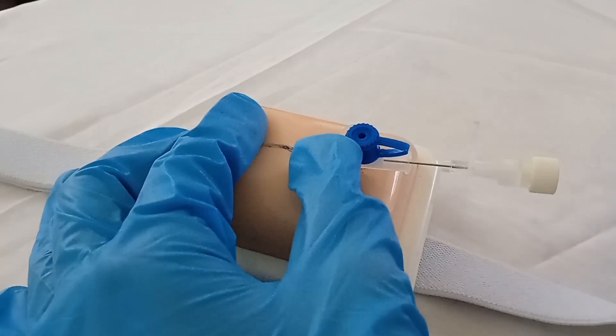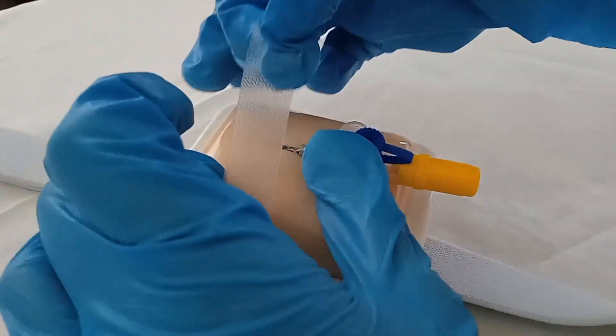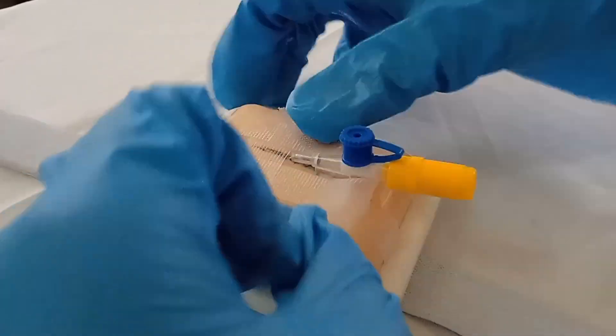Release the tourniquet. Remove the stylet while applying digital pressure over the catheter with one finger to prevent blood from oozing out. After doing all that, we can now proceed with flushing the IV catheter, which is done to prevent blood clots from forming. And then, we can anchor the IV catheter in place using transport tapes to prevent dislodgement. If it is already connected to a tubing, then we can loop the tubing. This provides a more secure anchoring of the IV catheter in place, and we can use a splint if needed to prevent the patient from any unnecessary movements that could dislodge the IV catheter.